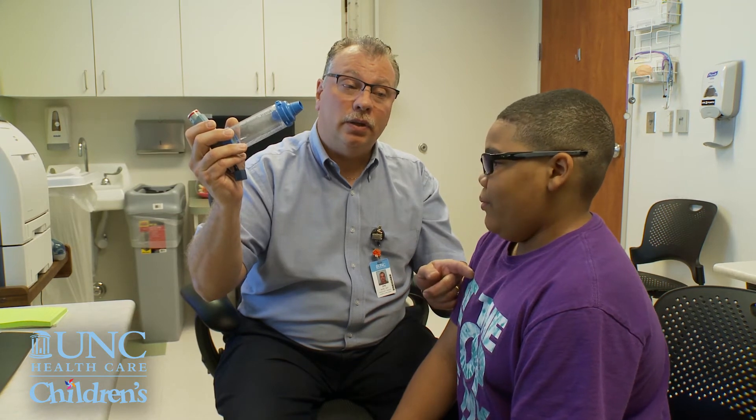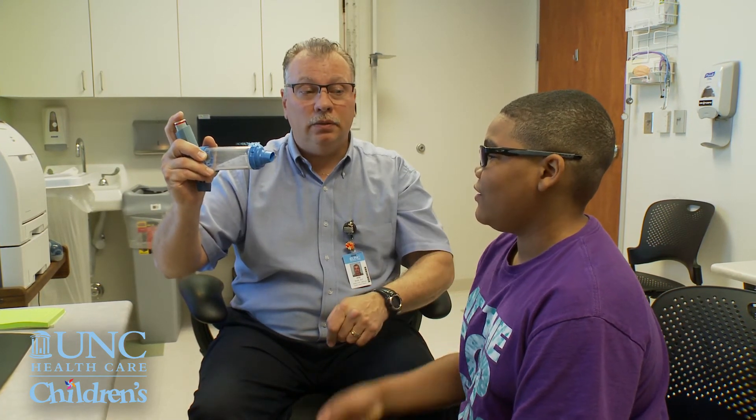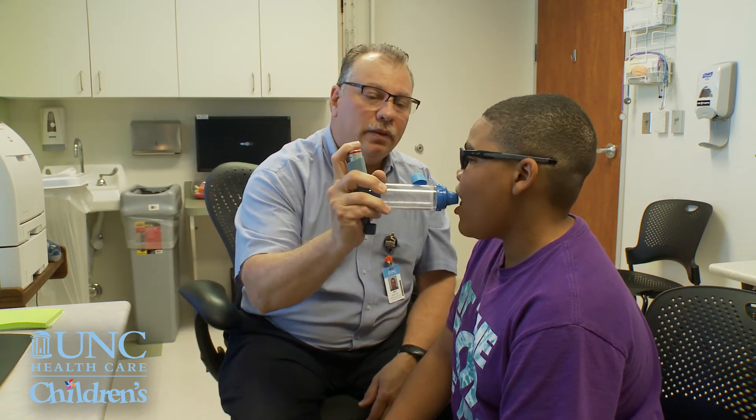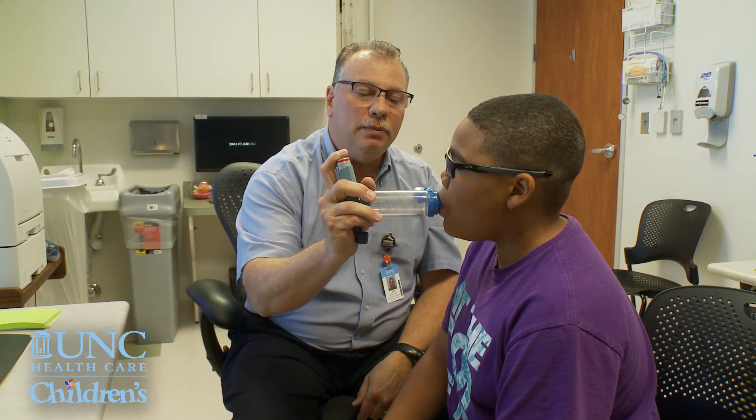Okay, now we're going to go ahead and do it. What are you supposed to do first? Shake it — for how long? Five seconds. 1,002, 1,003, 1,004, 1,005. Put it in your mouth, behind your teeth. Blow out all the way — empty, empty, empty.